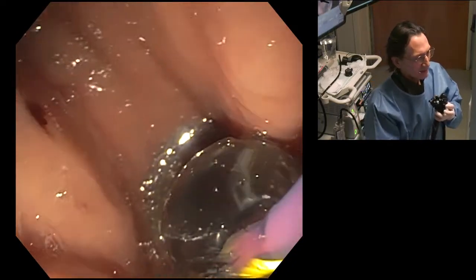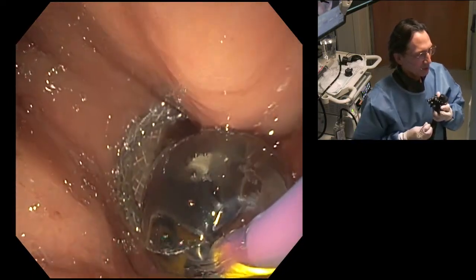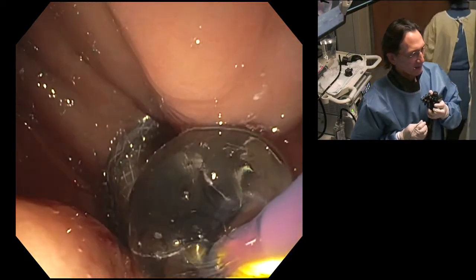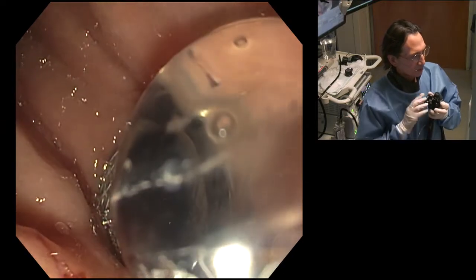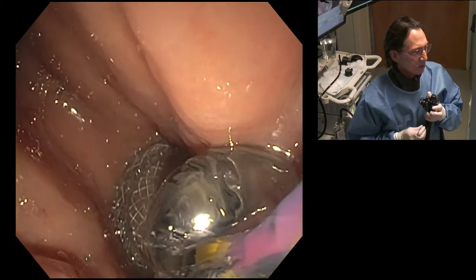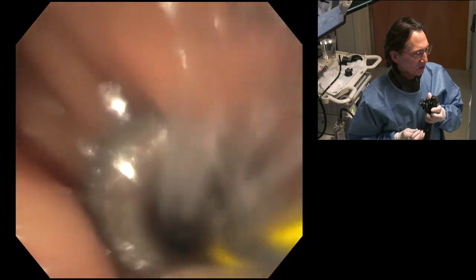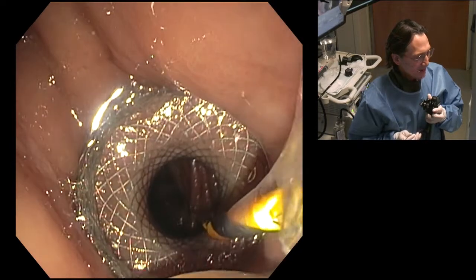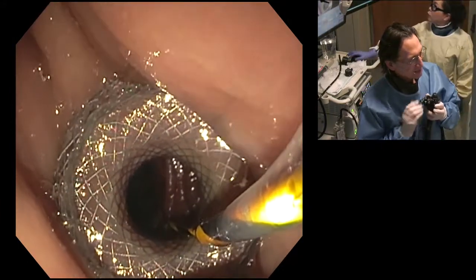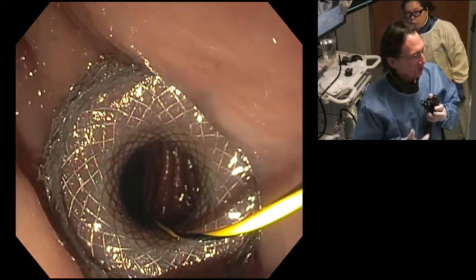That's good. And that's all we're going to do is the 12 here. Just hold it for a second. Let it kind of really go up there. Wait till the fight stops, and then we'll go back down, okay? We don't want to go up to the full 15 because we don't want to do anything that would risk that the stent could dislodge. It's unlikely. But now you have a beautiful view, right, of the distal duodenum/jejunum. No need to go through with an endoscope to convert it.